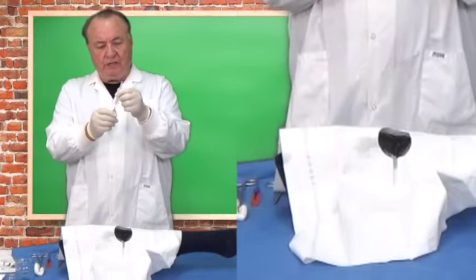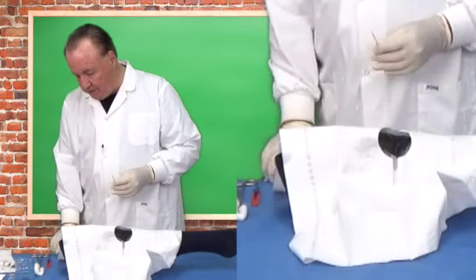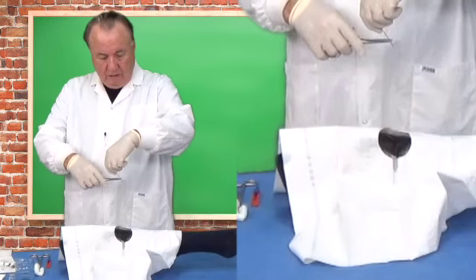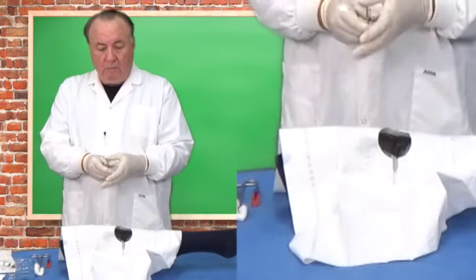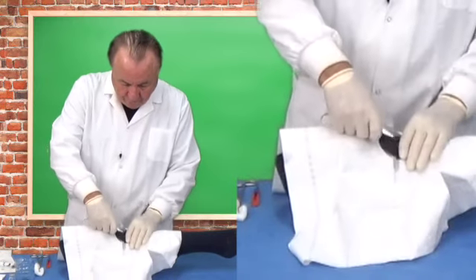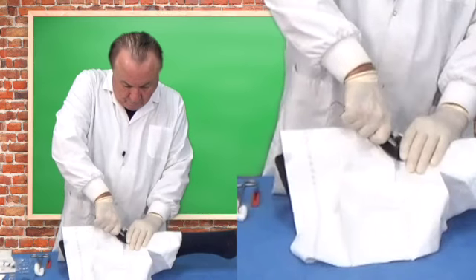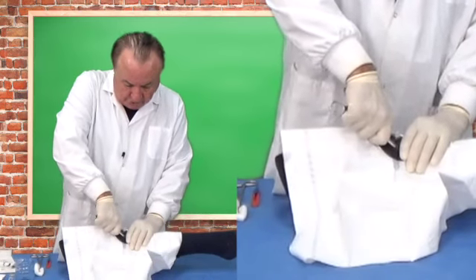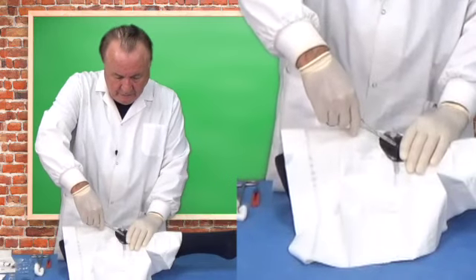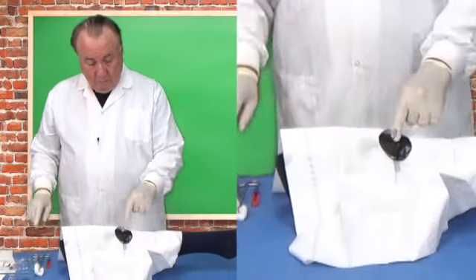We have a number 16 needle. There are all sorts of special devices. You're not likely to have those in Africa, certainly in the under-resourced setting, but you will have a heavy needle and you will have a needle holder. And using a boring action, you can insert it. You feel it give as it goes through the cortex into the marrow.